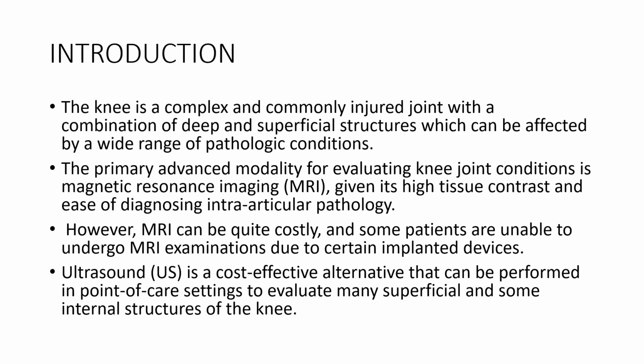Knee, as we know, is a complex and commonly injured joint with a combination of deep and superficial structures which can be affected by a wide range of pathological conditions. The primary advanced modality for evaluating knee joint conditions is MRI, given its high tissue contrast and ease of diagnosing intra-articular pathology. However, MRI can be quite costly, and some patients are unable to undergo MRI evaluation due to certain implanted devices. Ultrasound is a cost-effective alternative in such cases, which can be performed in point-of-care settings to evaluate many superficial and some internal structures of the knee.